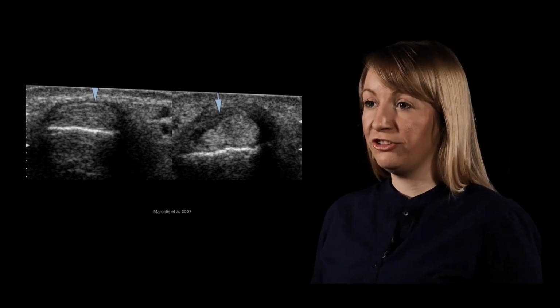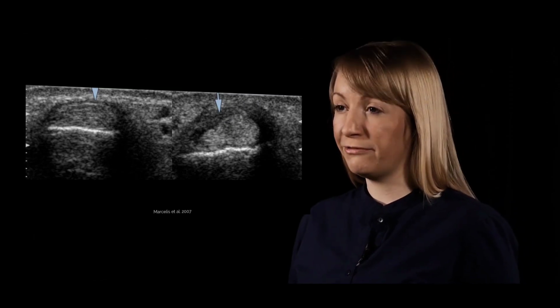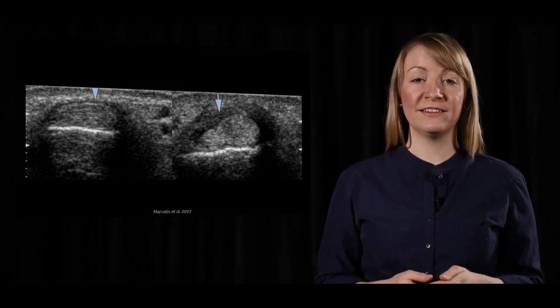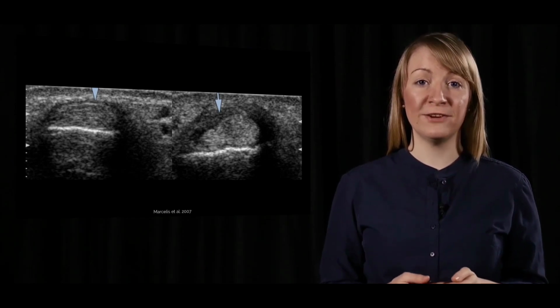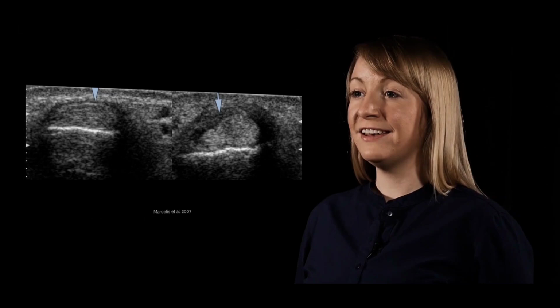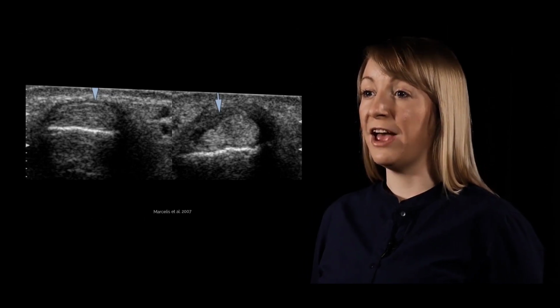Based on this static image, it cannot be confirmed whether there is a functional problem. We can assume, based on previous findings, that this patient shows a mild tendinopathy and a tenosynovitis. This patient should be scanned in the other plane as well to double-check the pathology.